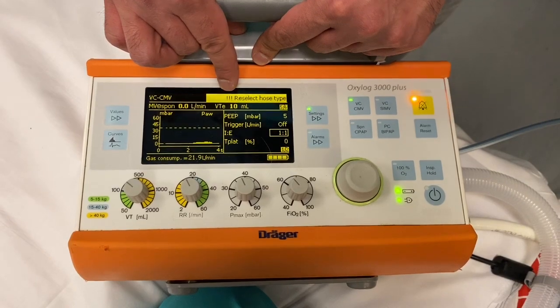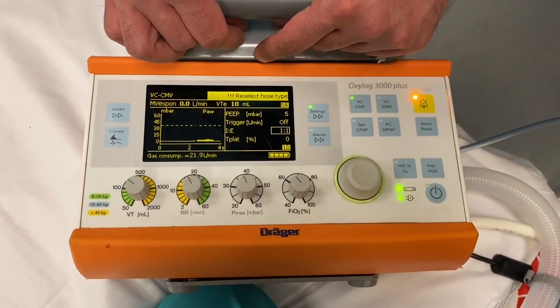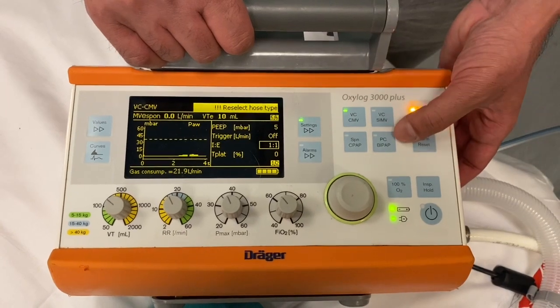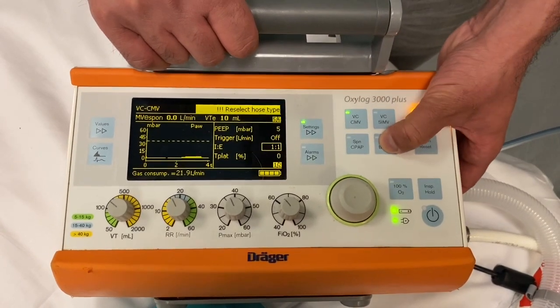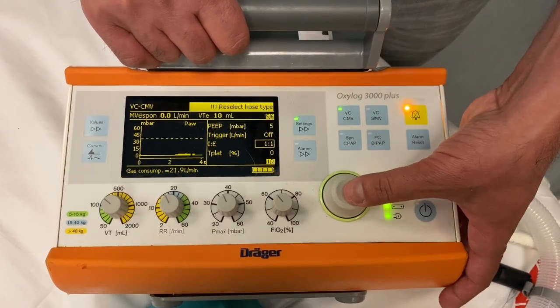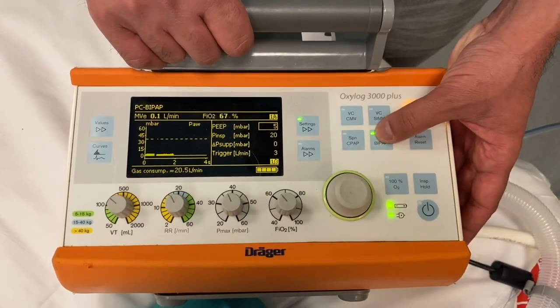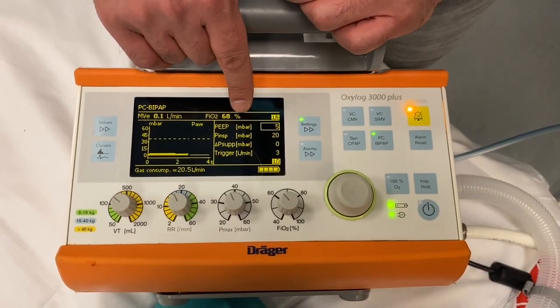However, in the meantime, to improve the ventilation of this patient we can change them on to the pressure control BiPAP setting by pressing the button, getting the flashing light, then clicking the knob to confirm until there is a solid light, and this will change the settings.